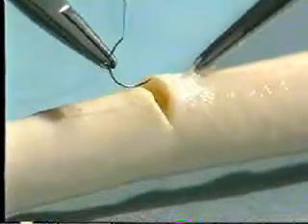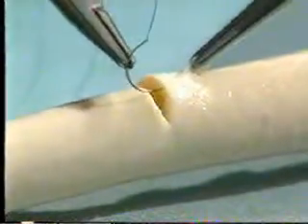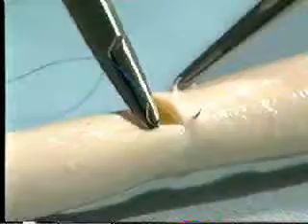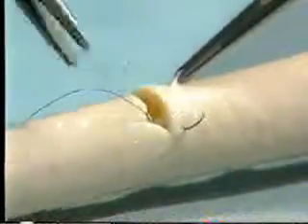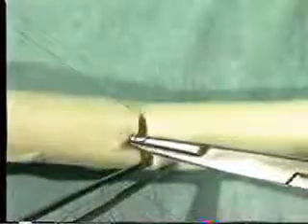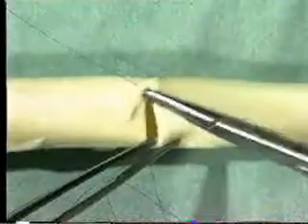For primary closure of the arteriotomy, use two appropriately sized double-ended arterial sutures. This allows stitching to begin in both corners of the incision and avoids the final suture being placed at the end of the arteriotomy. Commence at one end of the incision, passing both needles from inside to out.